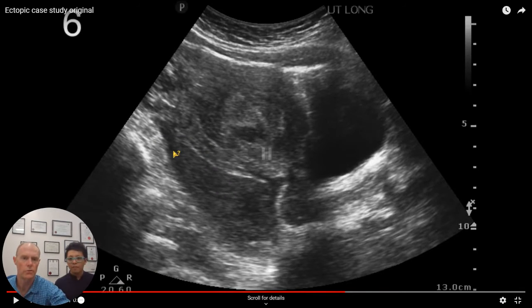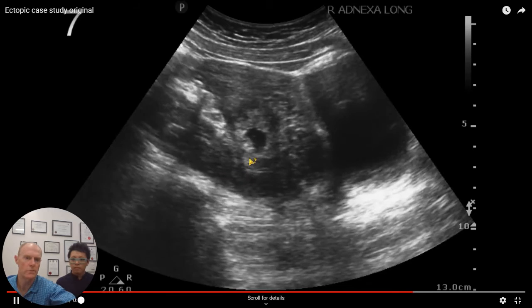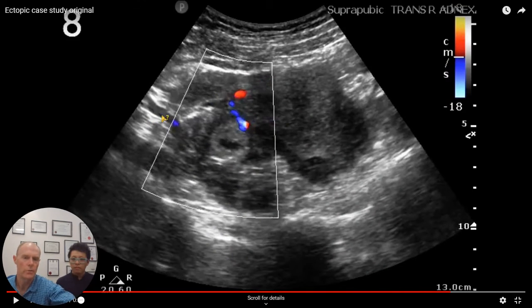This is a long axis view showing that the uterus itself didn't have any pregnancy in it. And down here behind the uterus is a big grey area which doesn't look like bowel, and that's actually clotted blood. So this woman, although denying she's pregnant, strongly suggests that she might actually be pregnant and has a pregnancy outside the uterus, and she's probably got a lot of clotted blood throughout her abdomen. And that's just a bit of a zoom view of this mass beside the uterus with a very prominent blood vessel going into it, which suggests that this is actively still bleeding whilst we're examining this woman.